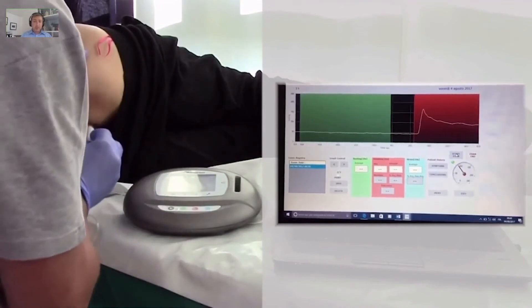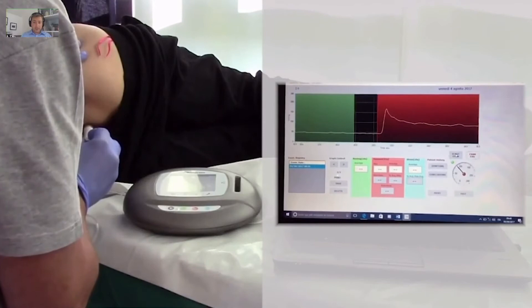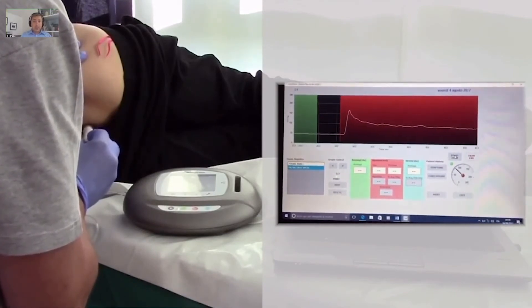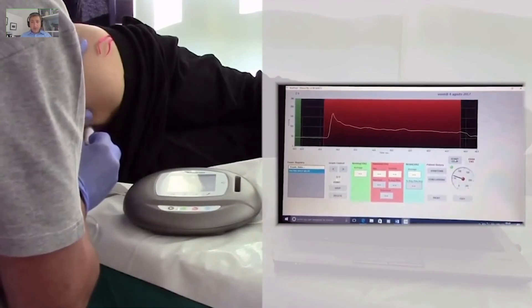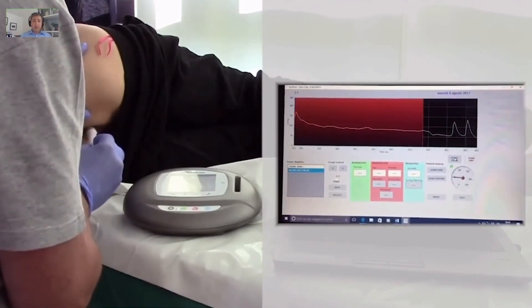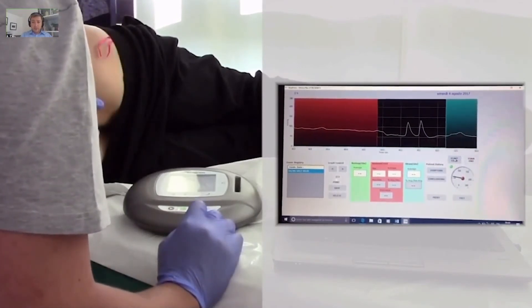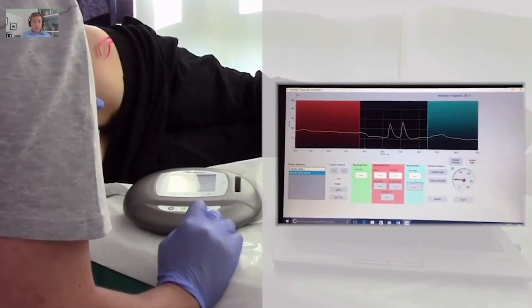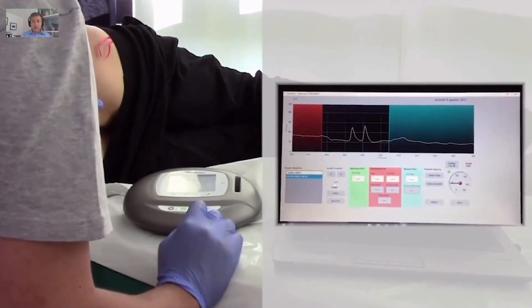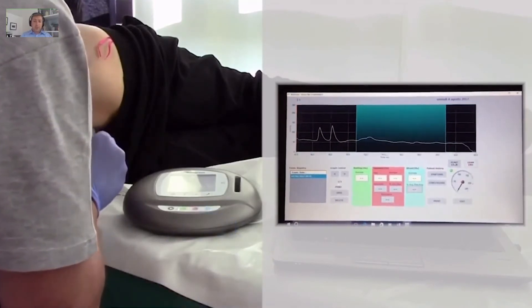Then we ask the patient to do a nice squeeze as strong as they can. You decide how many squeezes you want to take and how many recordings. Personally I prefer to take one single main squeeze pressure, and you see during the red phase all the endurance. I then ask the patient to do two involuntary squeezes by asking the patient to cough, and then we record the strain pressure by pushing the blue button.